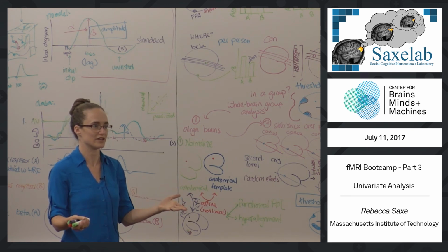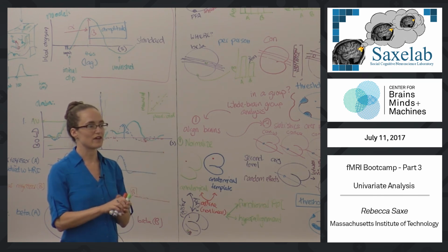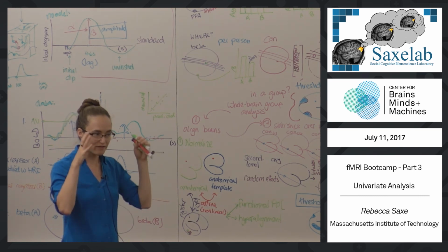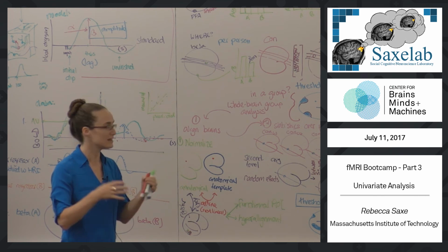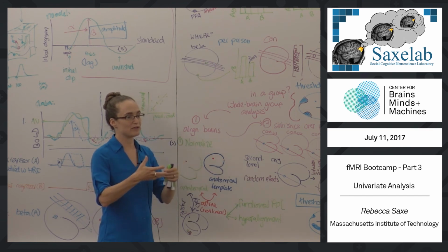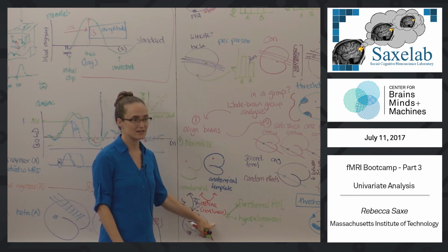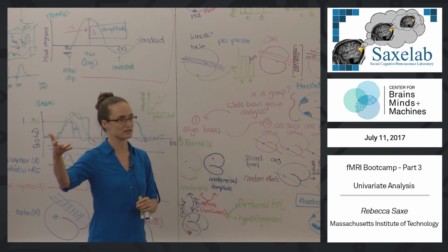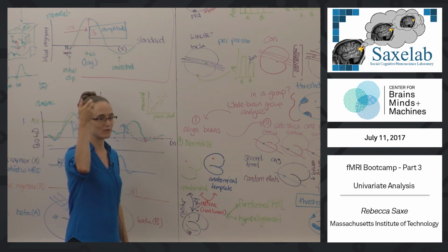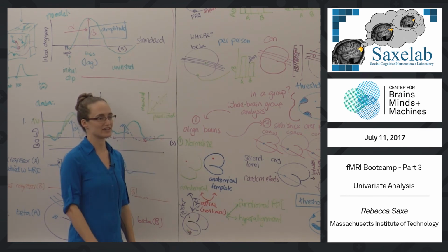And one way of thinking of place is voxel, which is frankly crazy. A voxel is a totally artificial thing. Another way of thinking of place is ROI. But all of these are different ways of solving the question, what is the same place in your brain and my brain? The way functional ROIs operationalize that, they say the three-dimensional volume that we collected is subsampled from the true structure of regions, and therefore the alignment problem is an alignment problem of regions. And we solve the alignment problem of regions with functional data and some spatial anatomical constraints. And then we align the two subjects' regions. Okay. And now they're aligned, and we do random effects statistics on them.